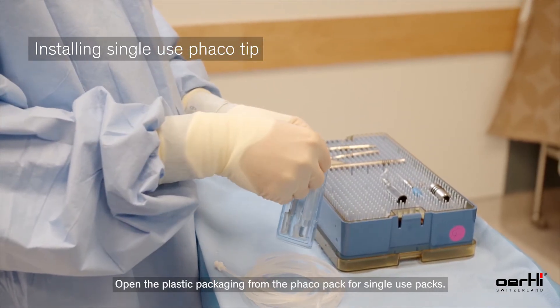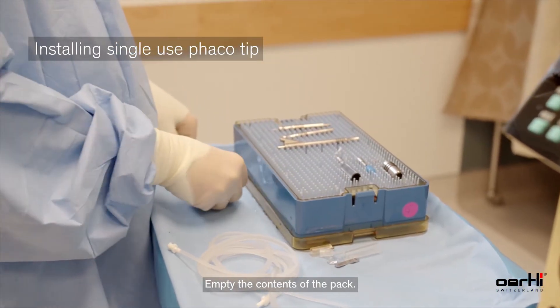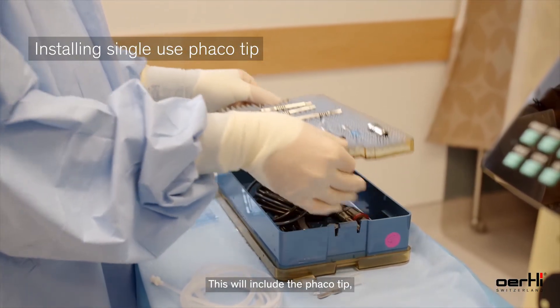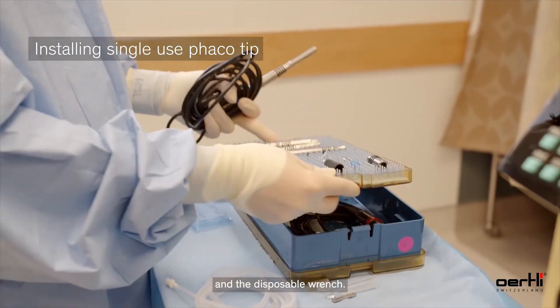Open the plastic packaging from the FACO pack for single-use packs and empty the contents of the pack. This will include the FACO tip, the test chamber, and the disposable wrench.